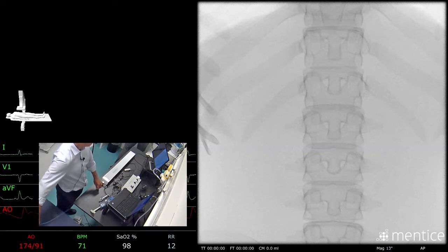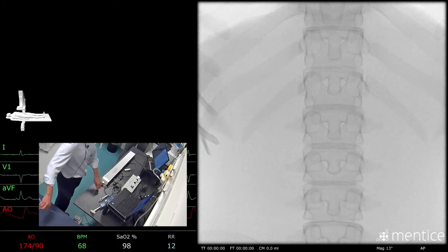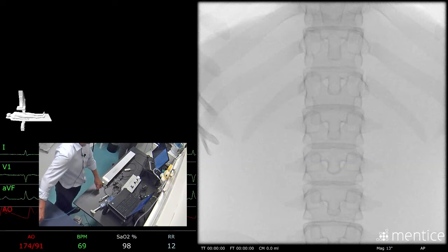Obviously, attention to the detail on the CT angiogram will help predict what's required, which includes the diameter of the balloon as well. In this particular case, this is a gentleman who has claudication at about 100 yards, and we know from his CT angiogram he's got a common iliac stenosis, and the vessels proximal to it measure approximately 10 millimeters.